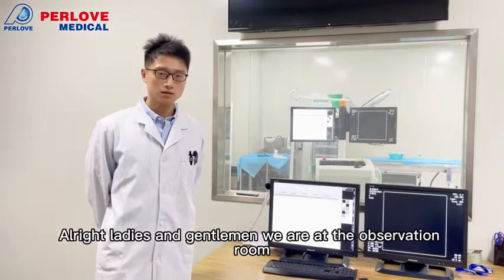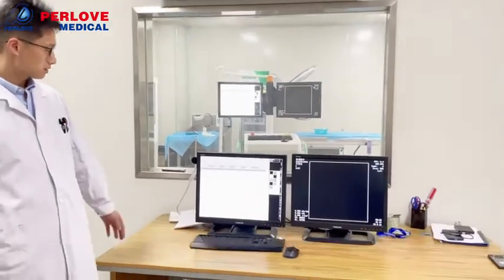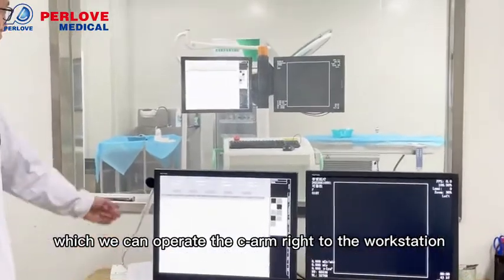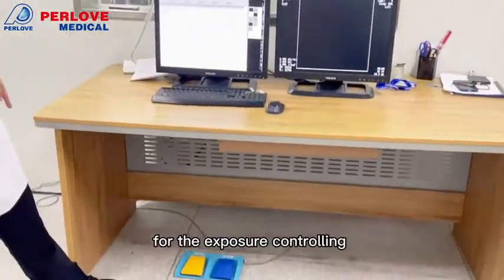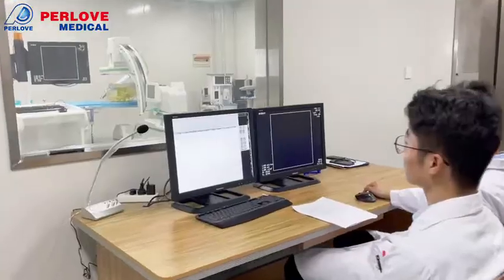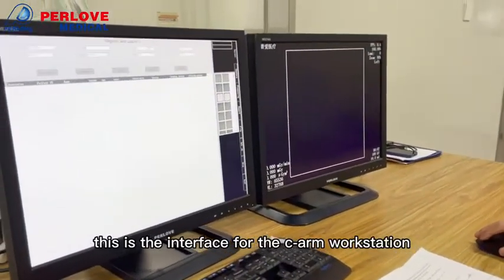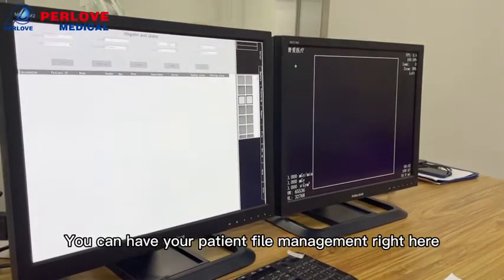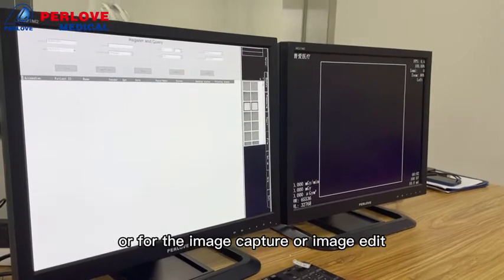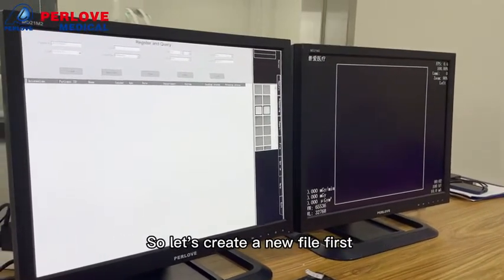Alright ladies and gentlemen, we are at the observation room. You can see we have two extension monitors right here, which we can use to operate the C-arm right at the workstation. We also have a foot switch for the exposure control. This is the interface for the C-arm workstation — you can have patient file management right here, or for image capture or image editing. So let's create a new file first.